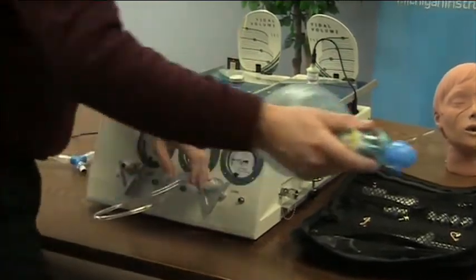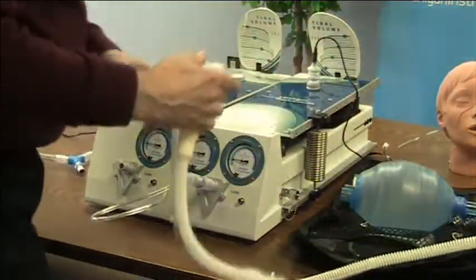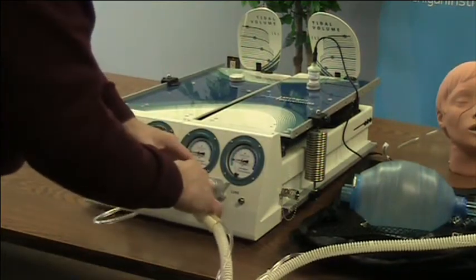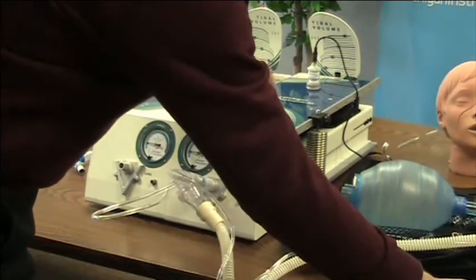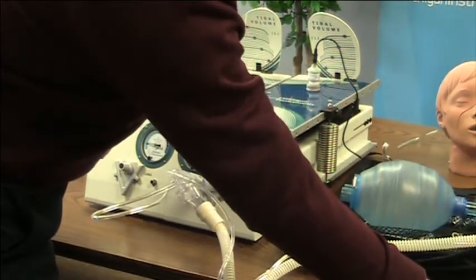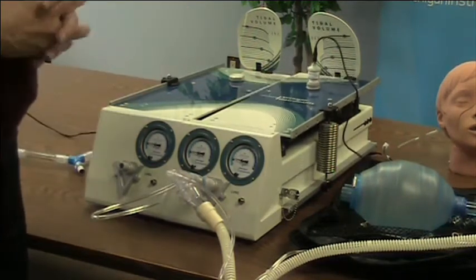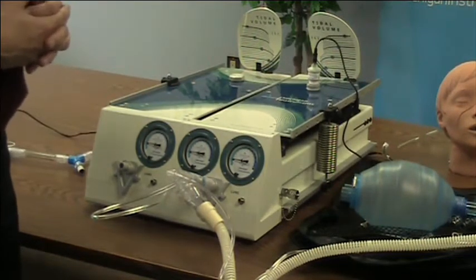Just to demonstrate, I'll hook up a simple ventilator to this side and let it do its work. I'll adjust this to a more typical patient — kind of a noisy ventilator, but there are all kinds.